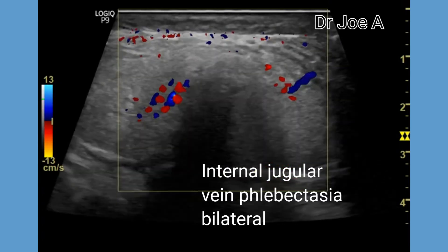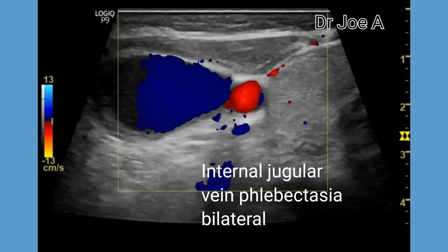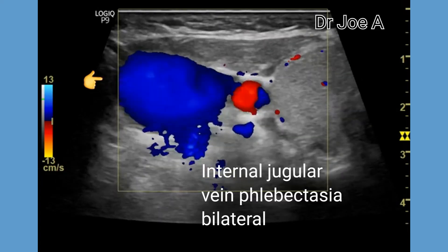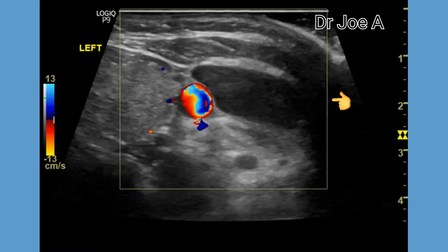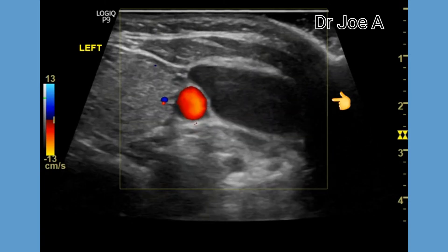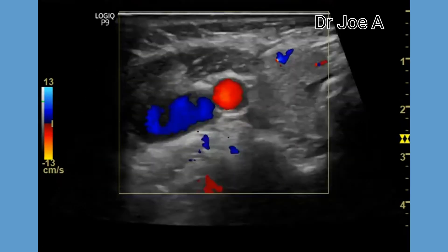The dilatation of the internal jugular vein is accentuated by Valsalva manoeuvre or by increased intra-thoracic pressure. Bilateral internal jugular vein phlebectasia, as in this case, is extremely rare. No treatment is usually needed in most cases.